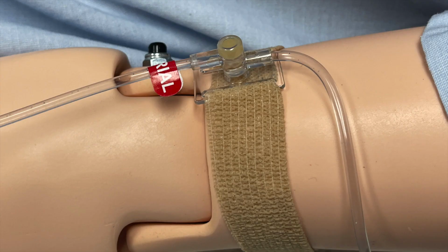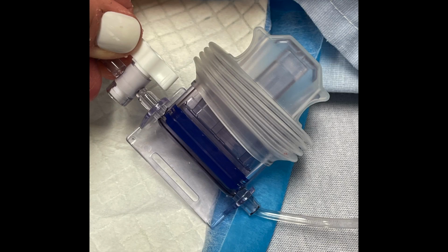Just above the three-way stopcock, there is an additional rubber stopper access site for specimen collection. This has to be accessed with a needle, therefore the stopcock method is safer. Additionally, you will note that this device here was not on the original art line that we reviewed. This is called a safety fluid reservoir.